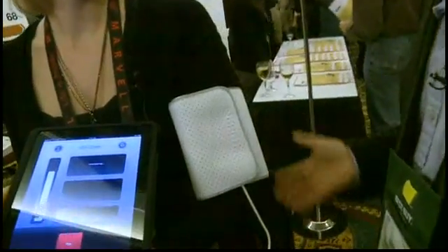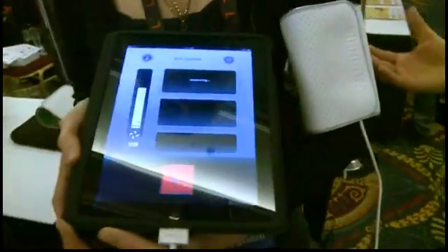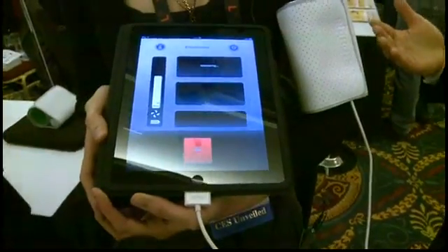What typically happens is it inflates up to a certain level and then it starts letting go, and then it looks for the upper point of your blood pressure and then the lower part. You know where your blood pressure is — where it's pumping and where it is when it's resting.